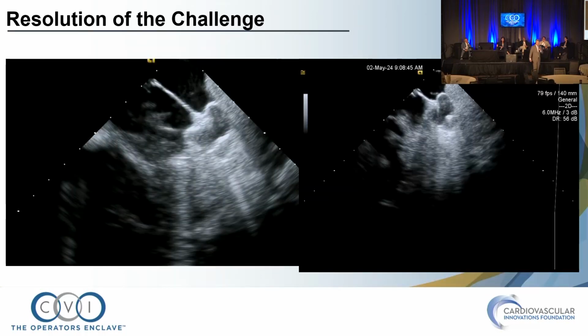This image on the left doesn't play. This is the mitral view, done under ICE. And you can see that, and I expected this was going to be proud of the ostium. I knew this was not going to be a flush appendage closure, so we're going to be proud. The question is whether or not we have fabric apposition on the appendage all the way around.